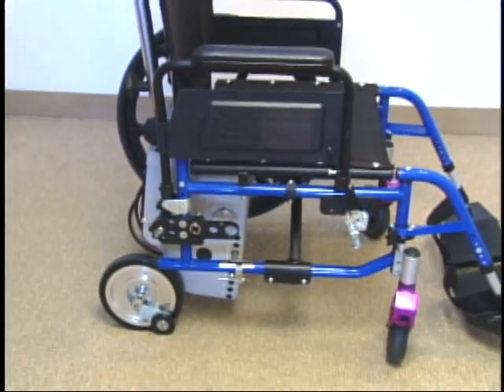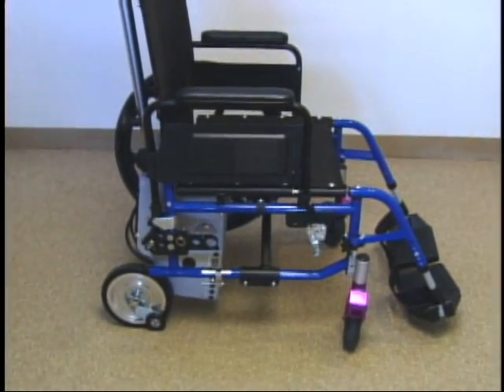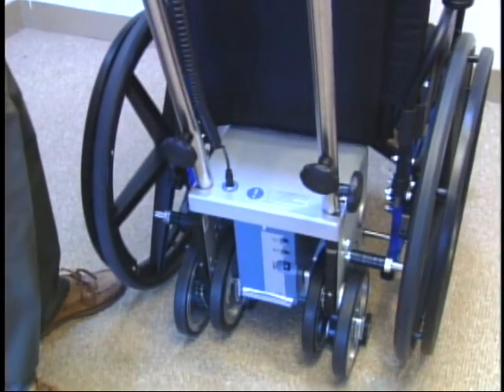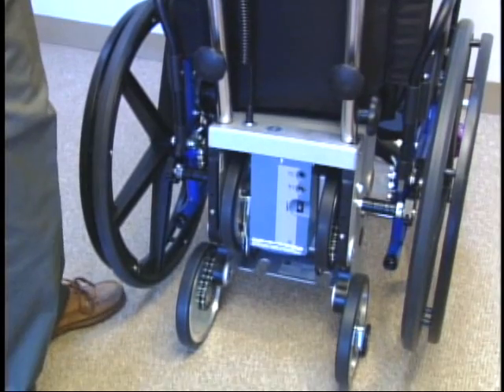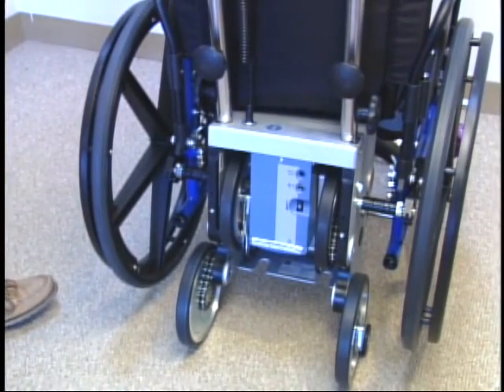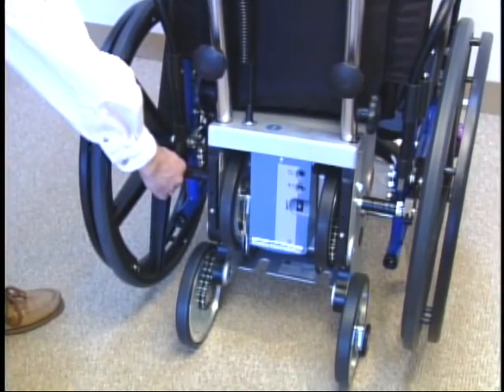A bracket installation allows perfect positioning of the Scattermobile, making its operation effortless. After rolling the Scattermobile underneath the wheelchair, three stainless steel rods connected to the Scattermobile slide into the wheelchair brackets and are secured by special quick-release pins. These pins cannot slide out of the brackets unless a safety button is pushed to release them.